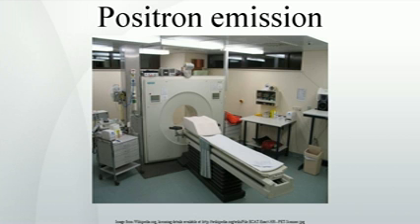At present, however, by far the most commonly used radiotracer in clinical PET scanning is fluorodeoxyglucose, also called FDG or fludeoxyglucose, an analog of glucose that is labeled with fluorine-18. This radiotracer is used in essentially all scans for oncology and most scans in neurology, and thus makes up the large majority of all of the radiotracer, greater than 95%, used in PET and PET-CT scanning.